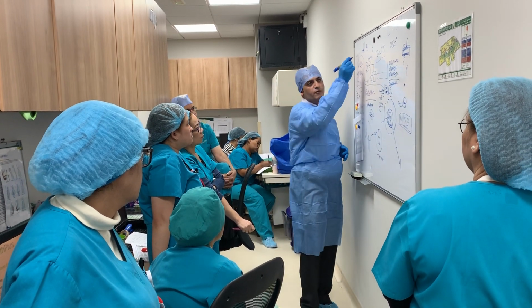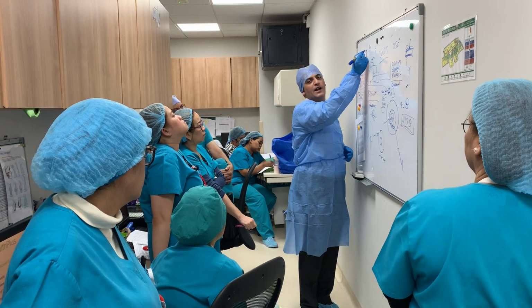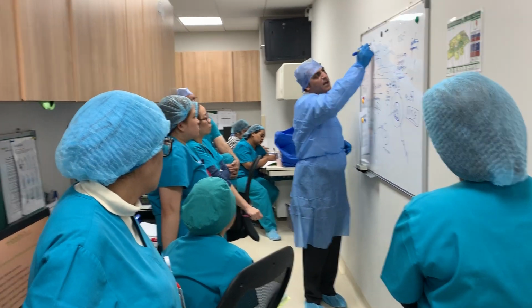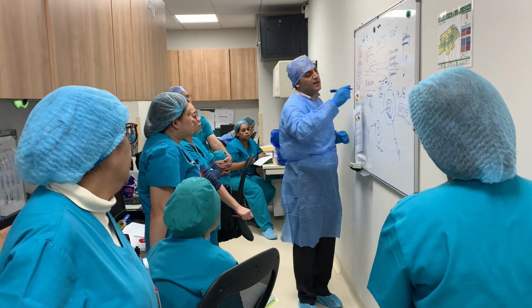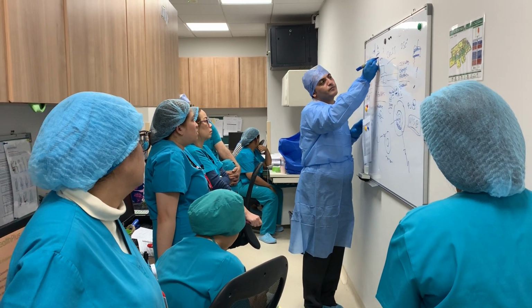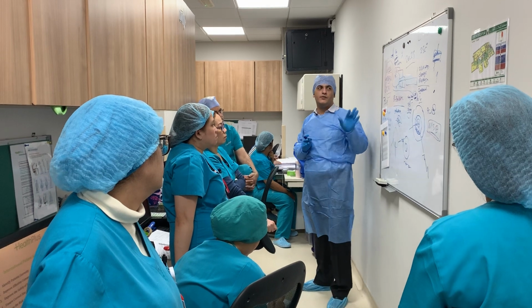A very simple procedure for washing. All you have to do is have the tube close to the magnet. The magnet will attract the particles to the wall, and then you go with a pipette and aspirate the liquid, the media, and discard it, put in your favorite media, and then shake it. As long as the media you're using doesn't have proteins and doesn't have egg yolk. Okay, that's all regarding this question.